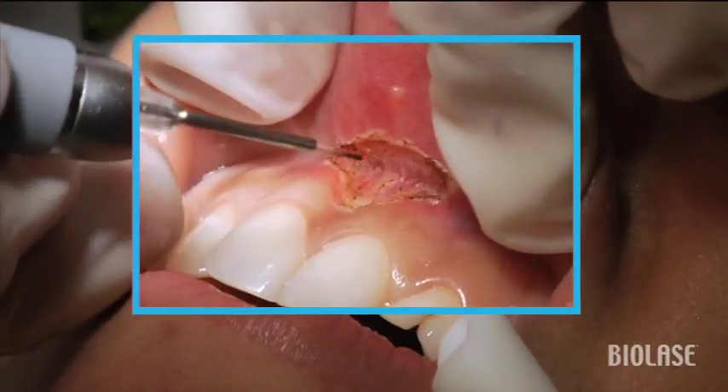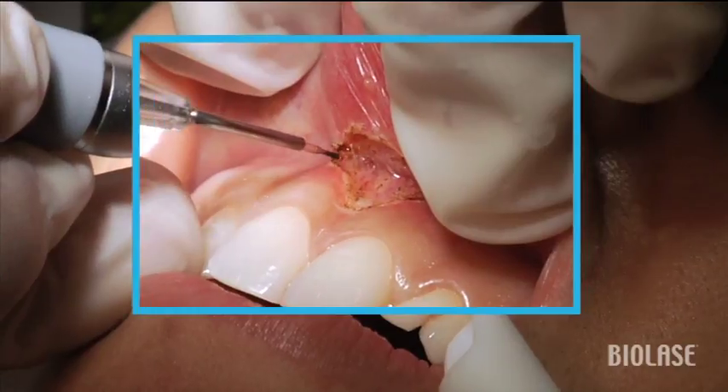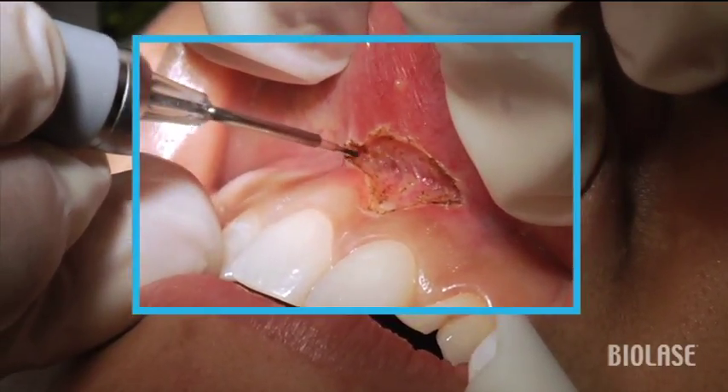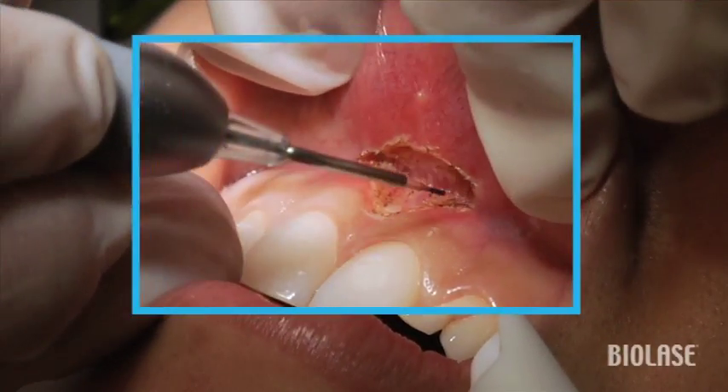A few times gently wiggle the tissue back and forth in order to exacerbate the muscle pulls visually. And then once you remove them, you can see that once you wiggle again, those muscle pulls essentially have disappeared, and this is exactly what you want to see. In general, you'll need to go a little more laterally than you really anticipate that you're going to have to.